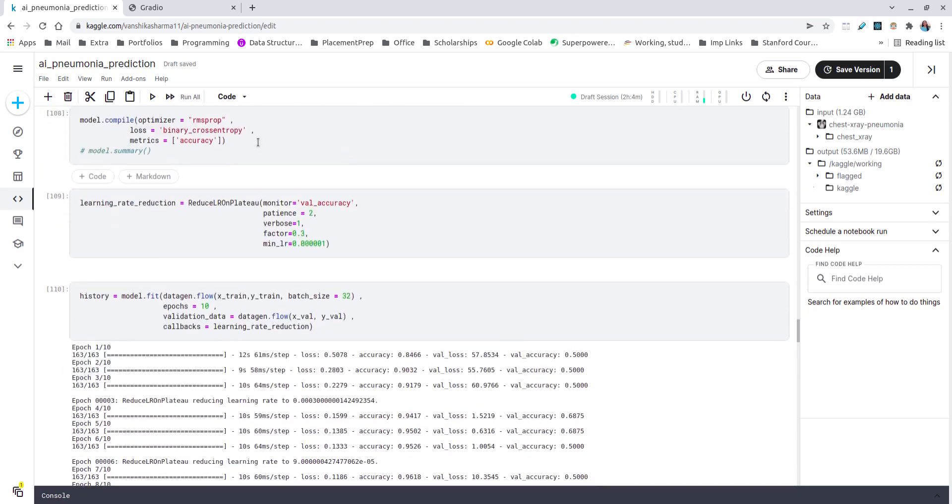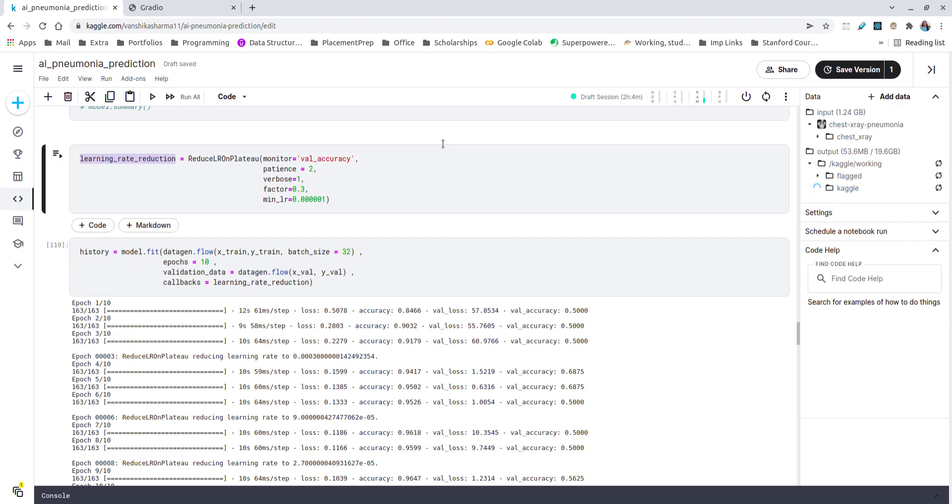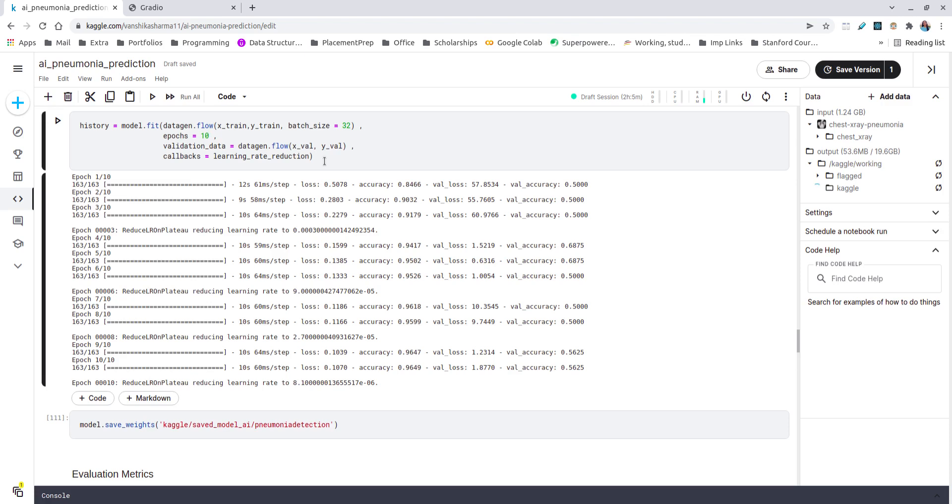Here I have just compiled my model with these following properties. In this particular cell I am trying to initialize a variable called learning rate reduction. What it does is, whenever it finds a plateau in the epoch loss curve—that is, a place where at the increase of epochs my gradient is not increasing, that I have reached a straight line, that my gradient is zero but it is not a minima—then reduce my loss so that I can at least move on at different parts of my gradient. Here I have tried to fit my model with only 10 epochs. In the very initial stage I tried going with 30 epochs, but eventually due to the limitation of my hardware I could not do it, so I limited my epochs to 10, which took me around two to two and a half hours to train per training. Then for my ease, I saved my model into the local directory of Kaggle.